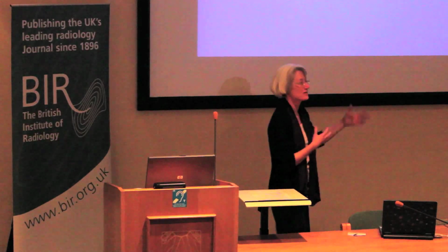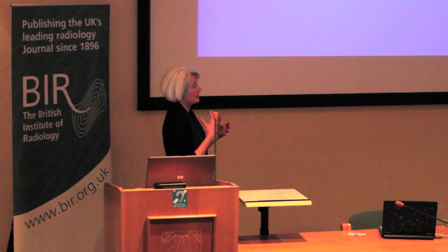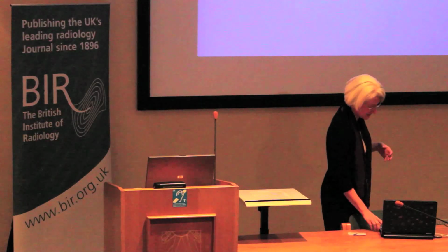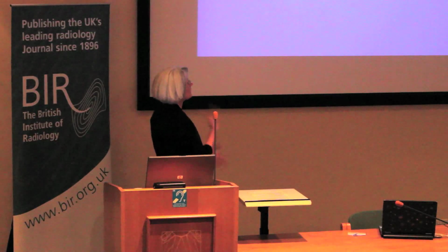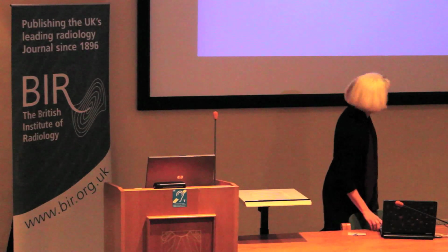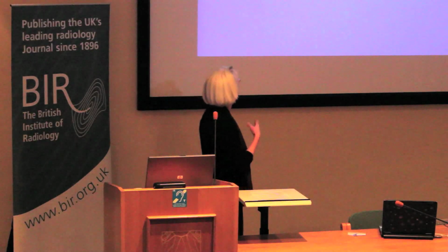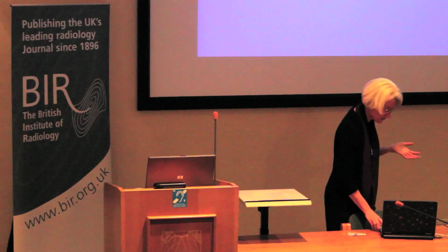And I should say the reason I'm doing this little bit of a lecture at this point is because I do a lot on MR safety, people write to me and ring me up, and I'm proud of doing MR. It's kind of upsetting when people ring with sob stories of things that happened to them. So if you give people headphones, earplugs, they won't think they've got tinnitus off your scanner, whether or not they have. If you've got people going to the scanner room, of course, if you're scanning pregnant women, you might have husbands and partners and mothers and fathers all around. All the normal screening is really important, and of course everybody in this room knows it.